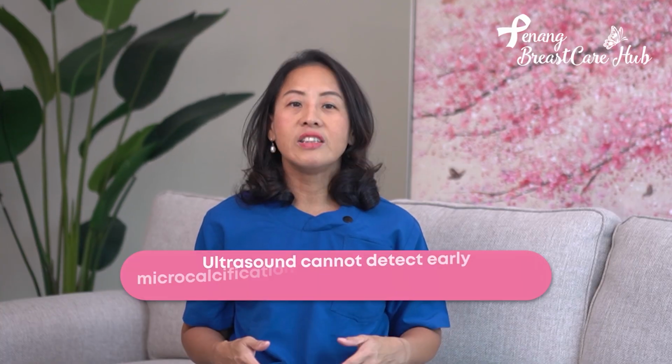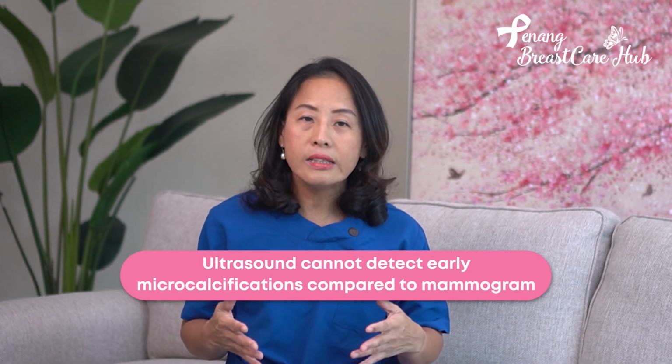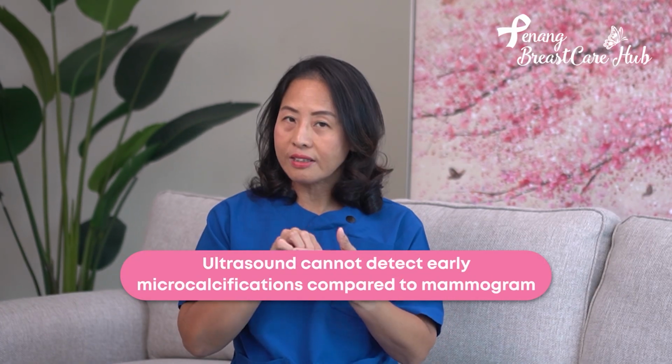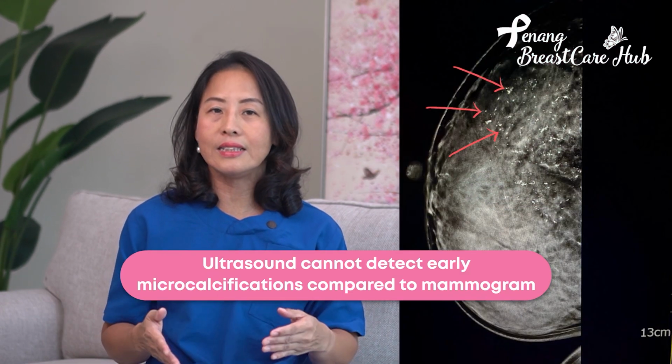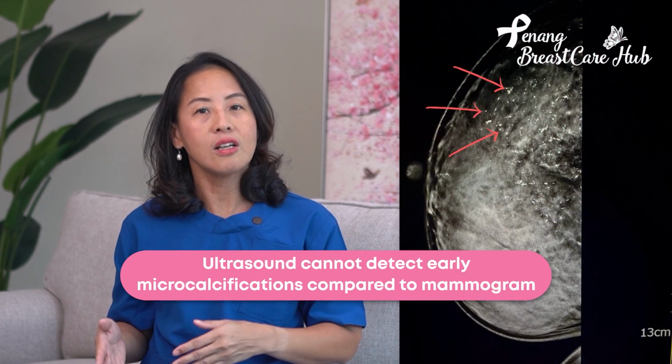There are limitations in breast ultrasound as well. They cannot identify early microcalcifications, which are little white dots that can be seen in early breast cancer like DCIS, which are better seen on mammogram.